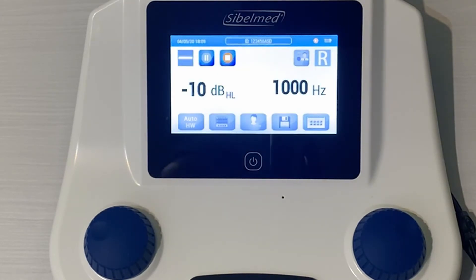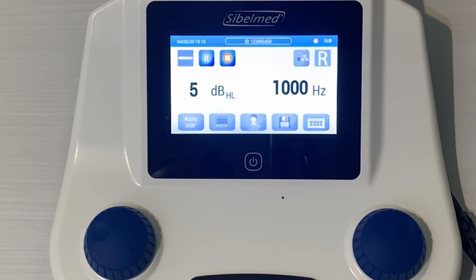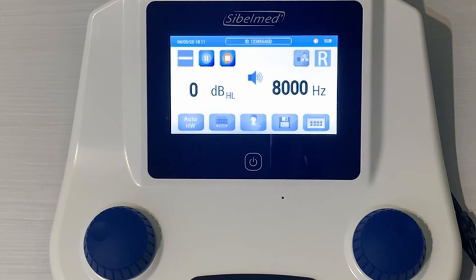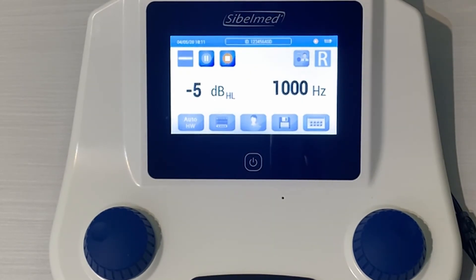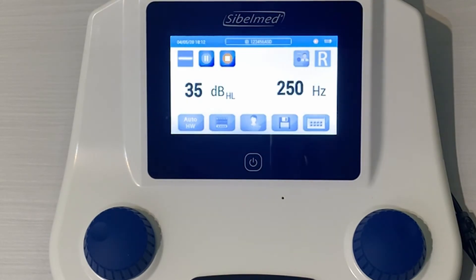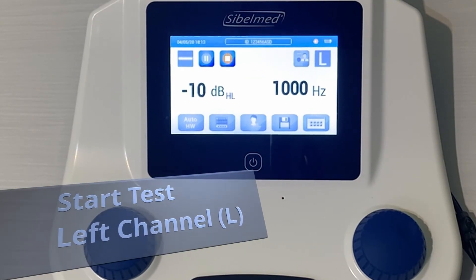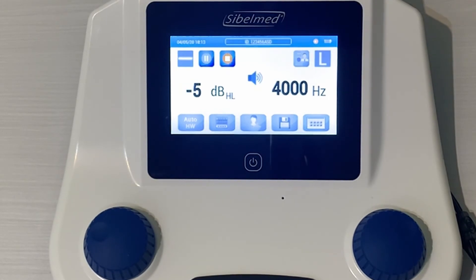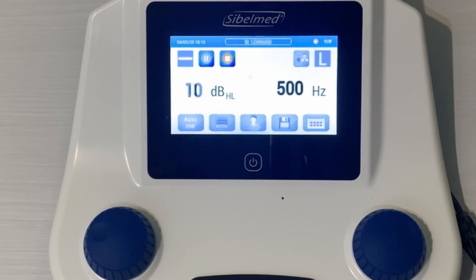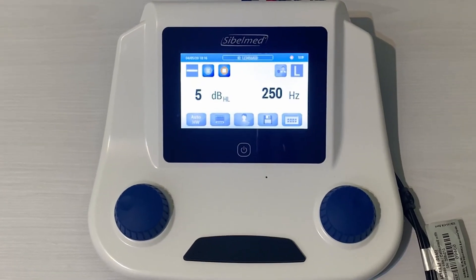If the difference between the first and second 1000 Hz exam is equal to or more than 10 dB, the message 'inconsistent results' appears, indicating the difference value, and the test stops. If the difference is below 10 dB, the test continues examining the lower frequencies. Once all frequencies for the first ear have been examined, the audiometer automatically changes to the other ear and examines it for all frequencies. For the second ear, the 1000 Hz examination is only performed once. After the process, the message 'test completed' appears.